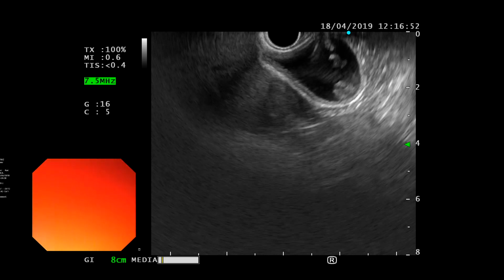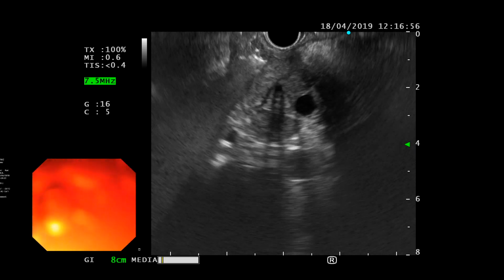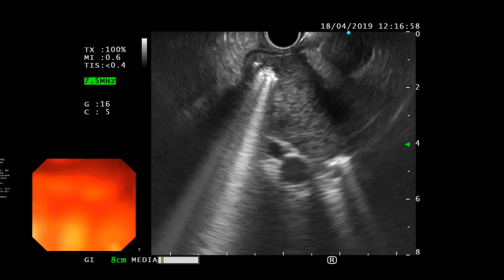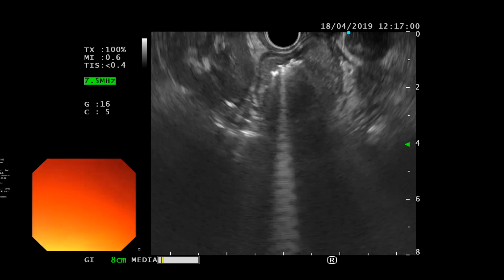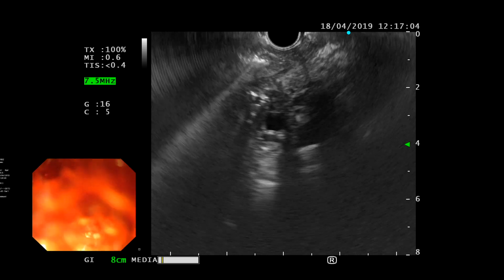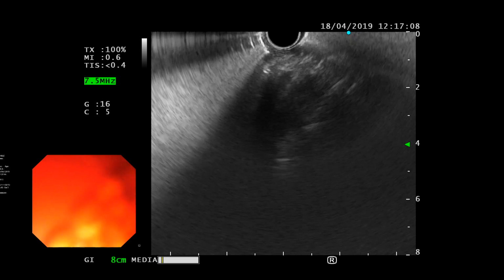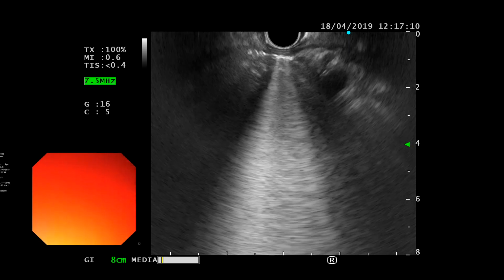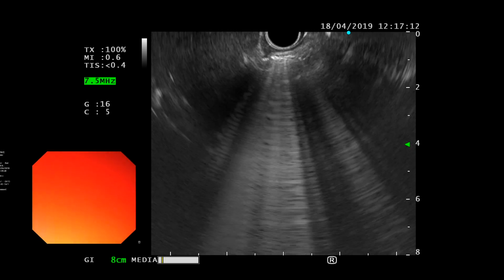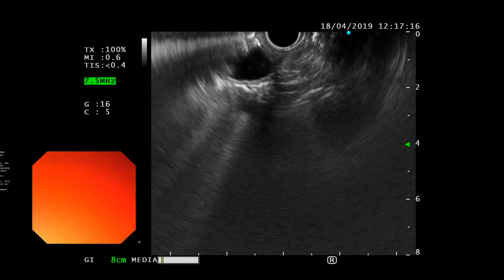So we have liver, gallbladder, and there's mass. And then as I go counterclockwise from there towards the hilum, I'm having a hard time orienting. We had a better view earlier, to be honest. Maybe I'm too far down. No, that's okay.